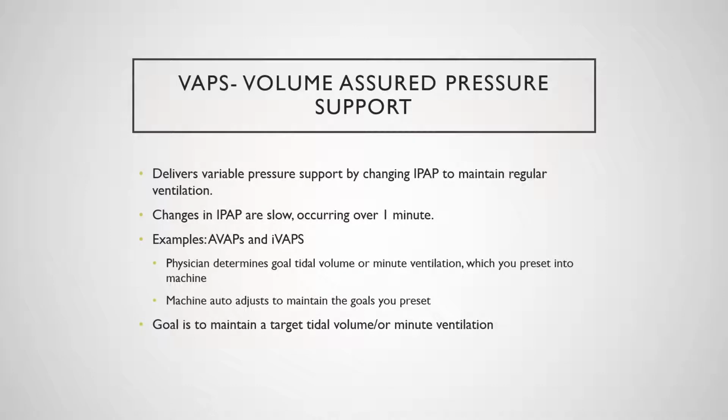Now VAPS, which stands for Volume Assured Pressure Support, is another mode of advanced therapy. This delivers variable pressure support by changing IPAP to maintain regular ventilation. However, with this device, the changes in IPAP are slow. They occur over 1 minute of time.